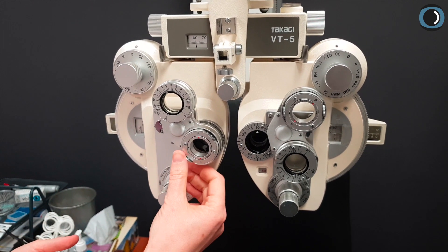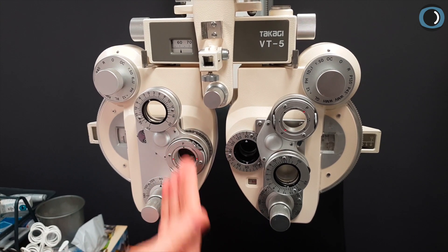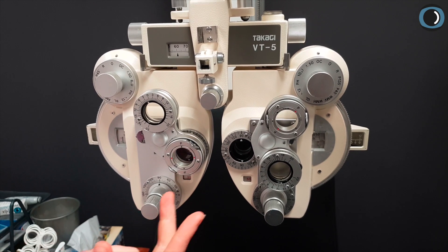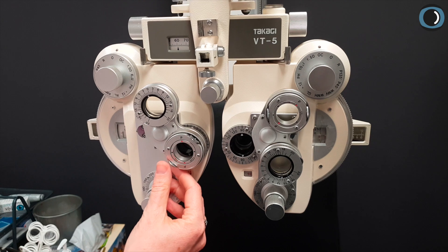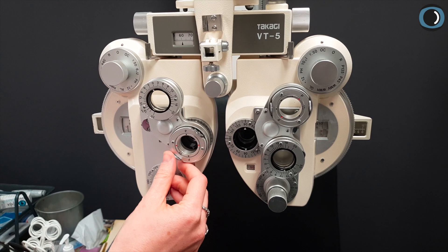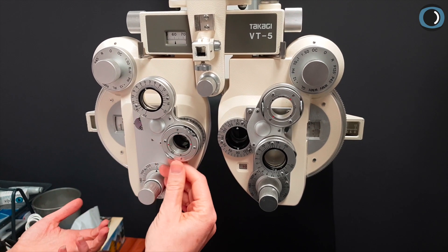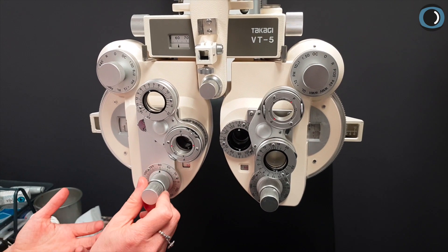I'm going to ask them which is better, one or two. Now if the answer is minus 025, they're going to prefer black. The reason why this is useful is that if you start them on minus 025 and this is the answer, there are two or possibly three answers. They might say they're the same, they might prefer red, or if they prefer black then we know we don't have any cylinder. It just makes it a lot easier for the patient when you give them an easy question first. So if they don't need this much cylinder, they'll prefer black — you've bracketed already and it's easy to go back from there.